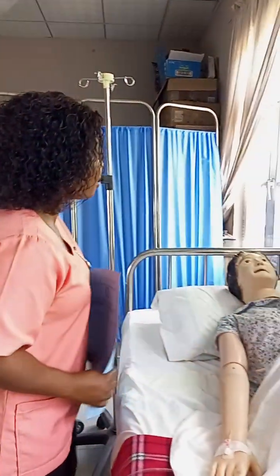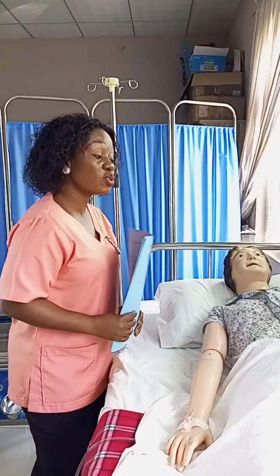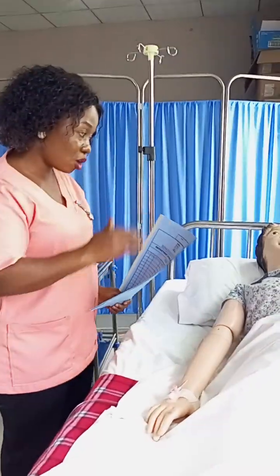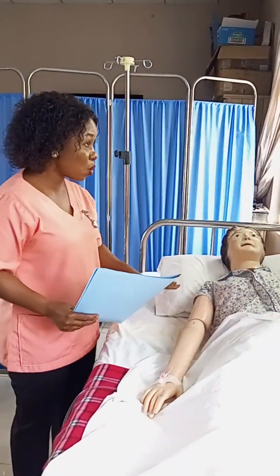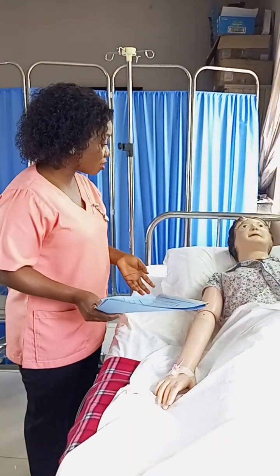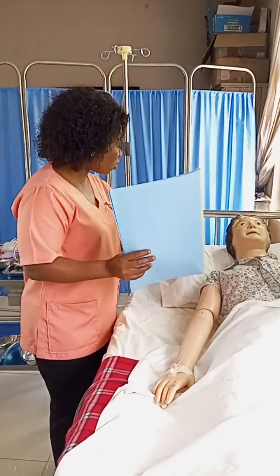I am here today to be your nurse. I'm here to transfuse blood. Remember, the doctor said your red blood cells have come down. It's low, so I'm going to transfuse packed cells to your system, only the red aspect of the blood.